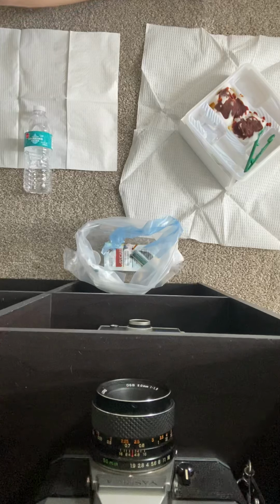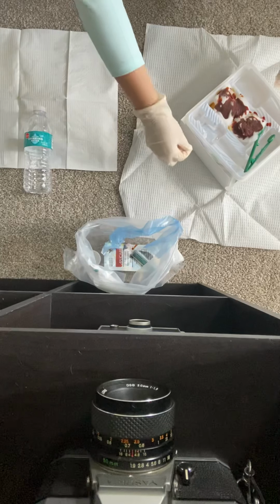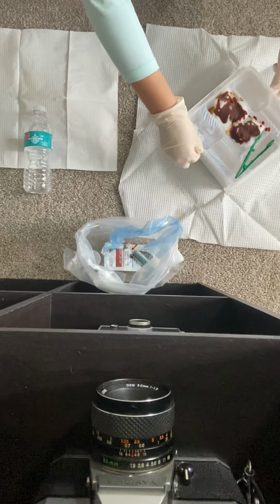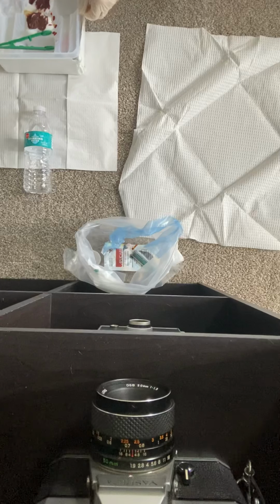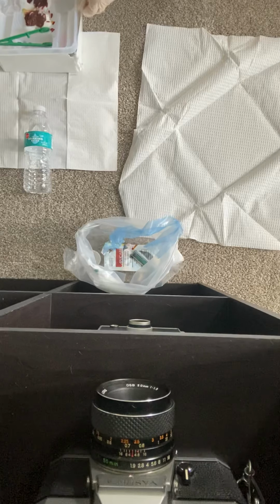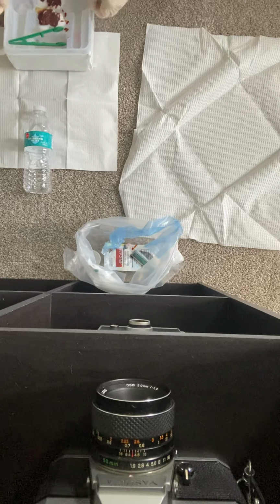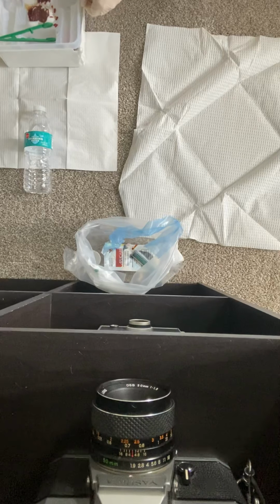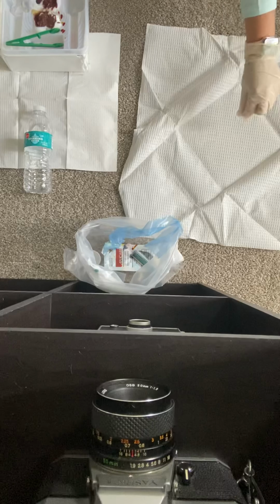move my entire kit in between my patient's legs. So I'm going to take this and move it. Sorry, I just want to make sure that you can still see. I'm going to adjust here a little bit.